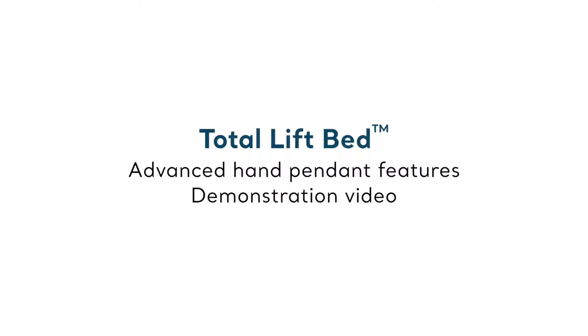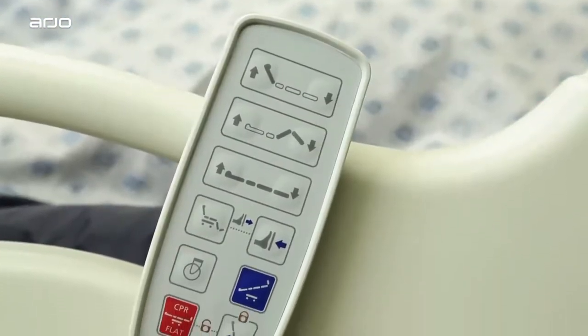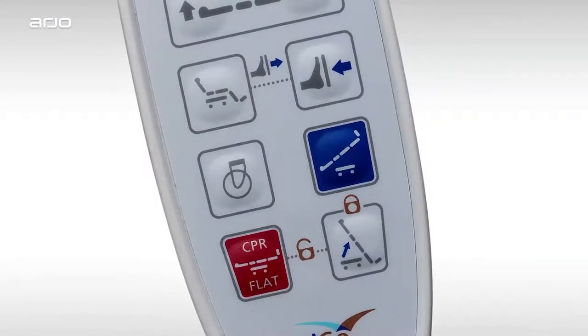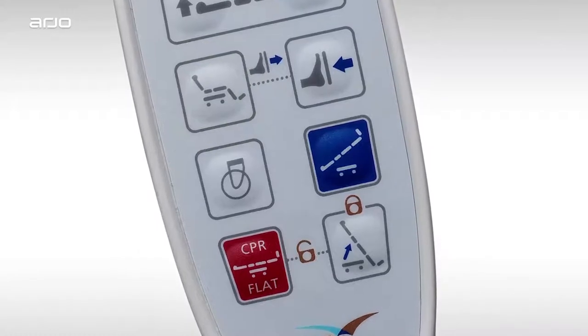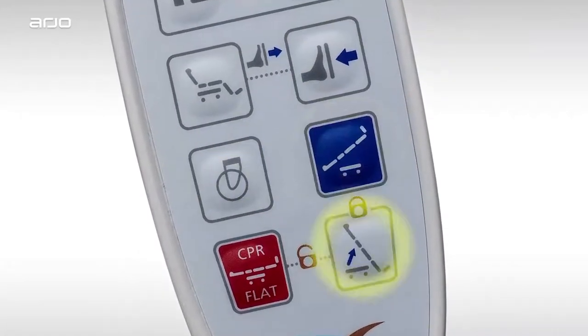In this section, we'll explore the Total Lift Bed Wired Handset Pendant. These handy controls bring added features and convenience, some of which can't be accessed from the bed frame control pads. These exclusive controls include chair position, foot lifter, caster, Trendelenburg, and tilt controls.